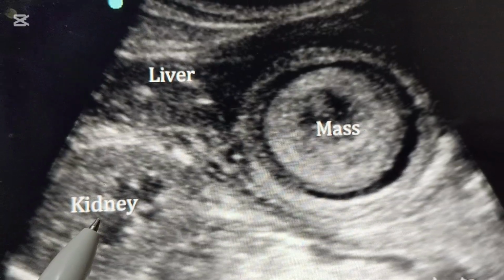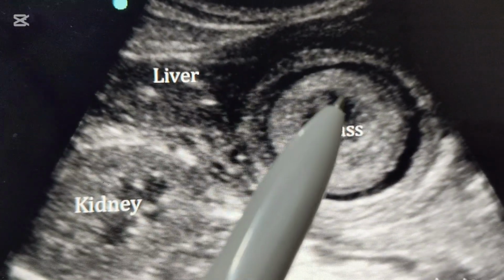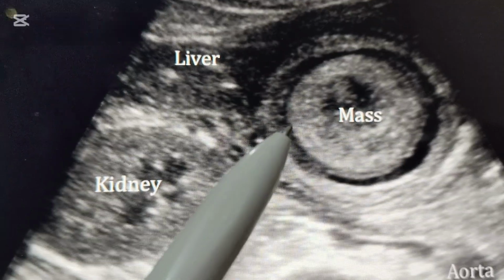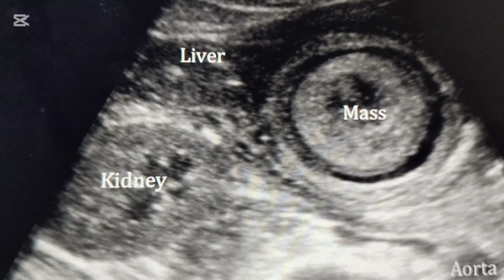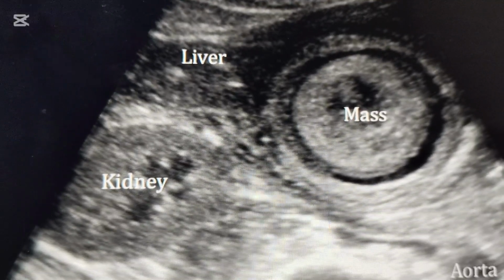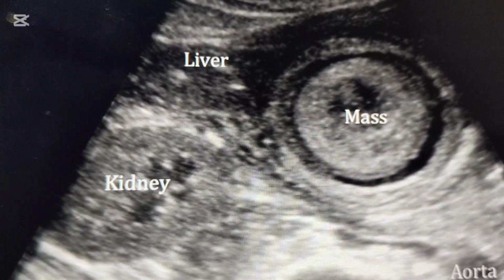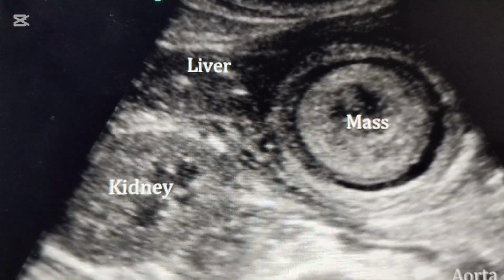So this is a right kidney, this is liver, and this is a gallbladder. Within the gallbladder is a heterogeneous area. Heterogeneous area seen within the gallbladder is most likely GB mass. This will be immobile with the position. But in case we see gallbladder sludge, that will move with the change of patient position.